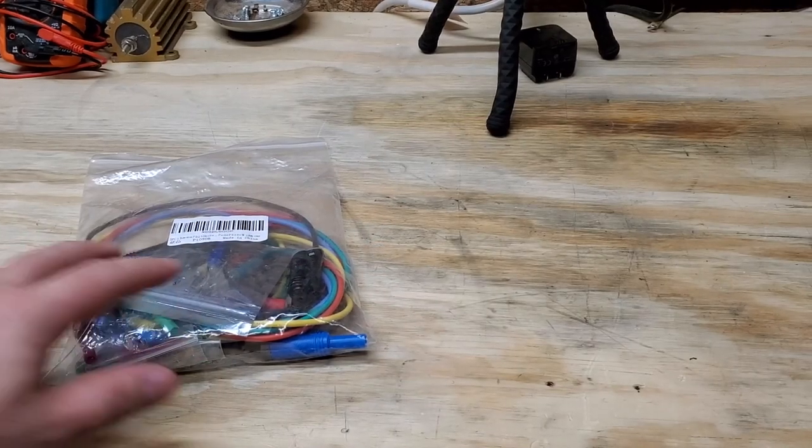Welcome back to Better Biomed. Today I'm going to share with you a hidden gem I found on Amazon of all places that is going to exceed — I think — OEM spec for the cables you're going to find for your analyzers. Let's go ahead and take a look at this incredible find from Amazon.